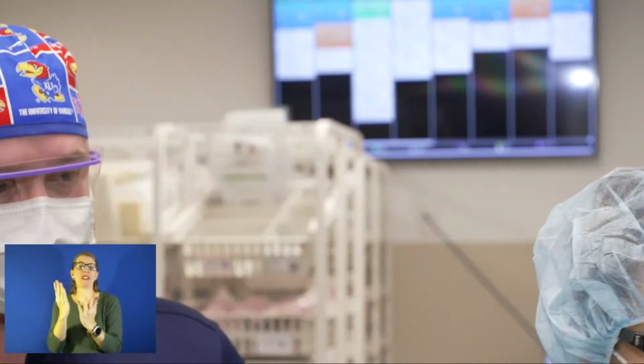And then can she go back to life as she knows it? What's the recovery time? So in general, no different than a patient who just has a lumpectomy alone. She'll have some mild surgical restrictions at the very beginning, but she should be able to get back to her normal functional status very quickly. We see people scooting by us, go on ahead. So what's happening right now? So we use an ultrasound to determine the distance from the skin to the cavity. So they're just taking that instrument out of the operating room right now.